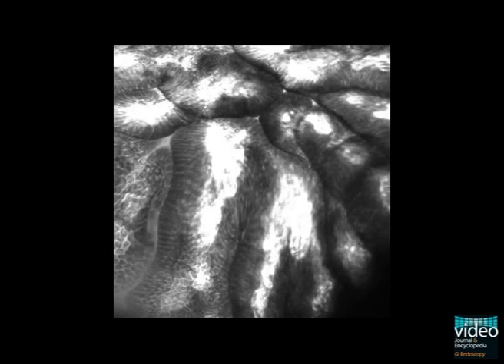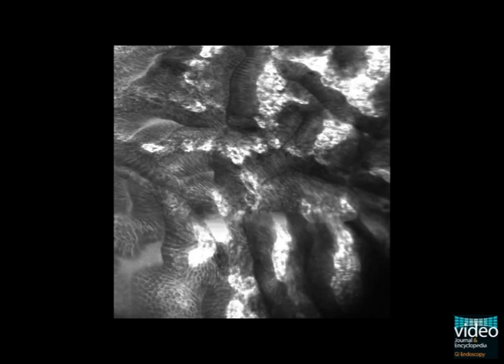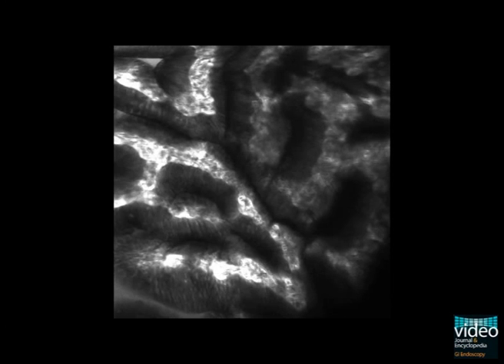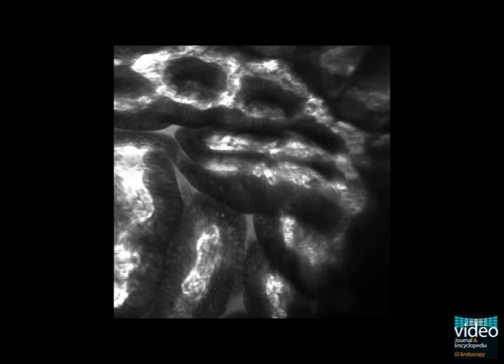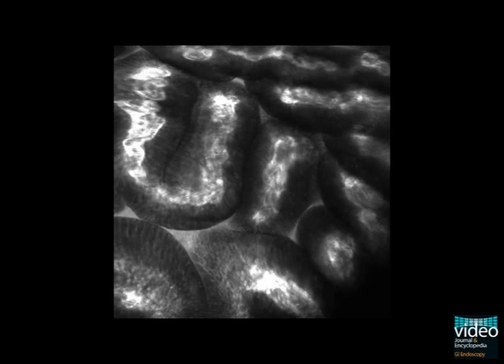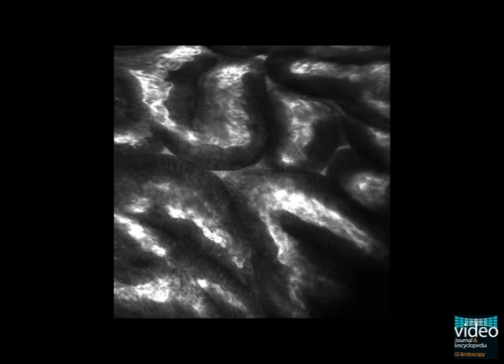The bright contrast indicates extravasation of fluorescein into the tissue, corresponding to the reddish areas. The capillaries are brightly contrasted with intraluminal fluorescein. Black dots in the lumen represent erythrocytes.